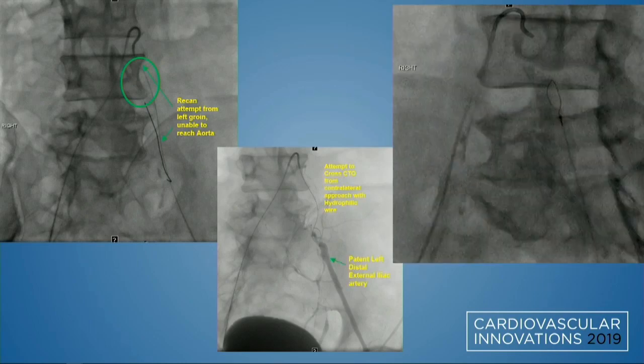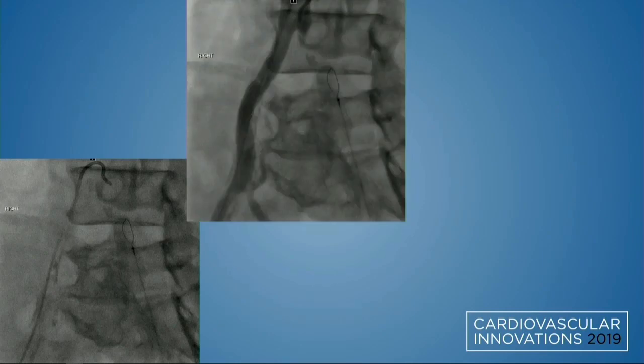And we like using snares a lot. I think it's a great tool to have for a target, either a catheter or a snare. And what you do is you try to get a wire, and sometimes you do go a little subintimal, but you can pop back in.